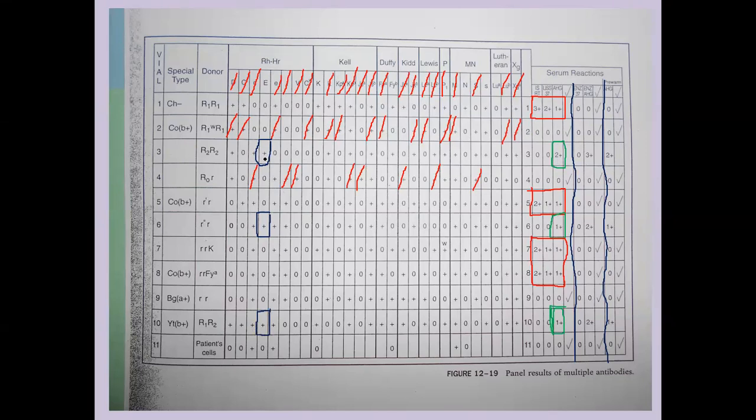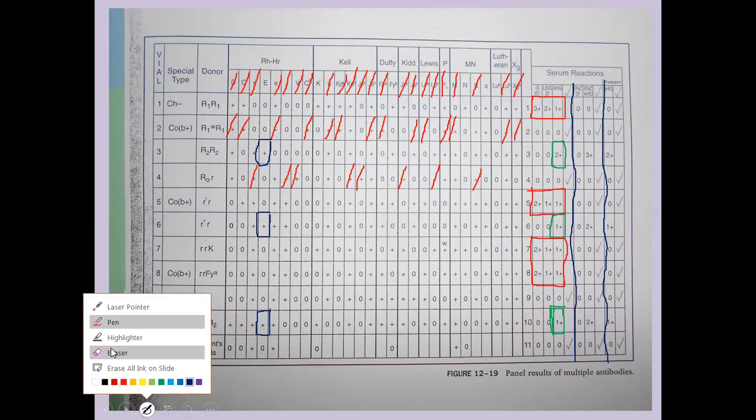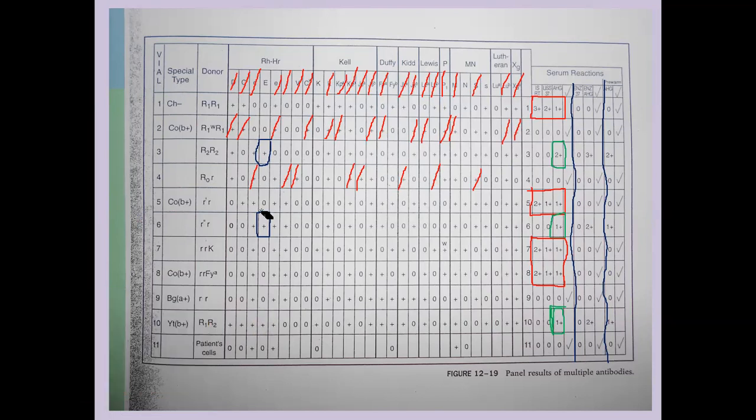Okay, so let's look at cell 3. Okay, E antigen is there. Oh, patient reacted 2+. Cell 6, E antigen positive. Oh, patient reacted. And cell 10, E antigen is there and patient reacted. Okay, so this pattern of reactivity looks like it's fitting my green outline over here. Maybe I should get my eraser and put them in green now that we know that.